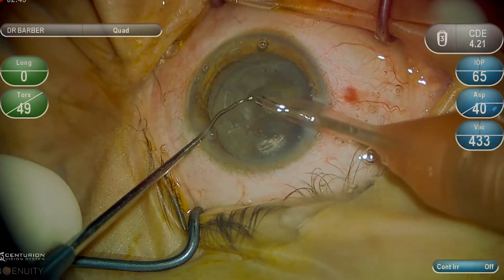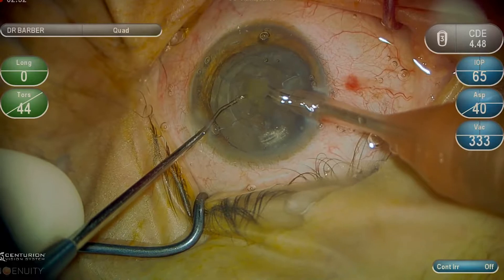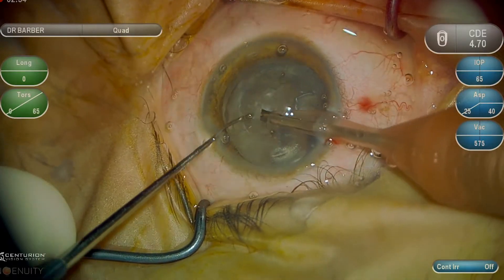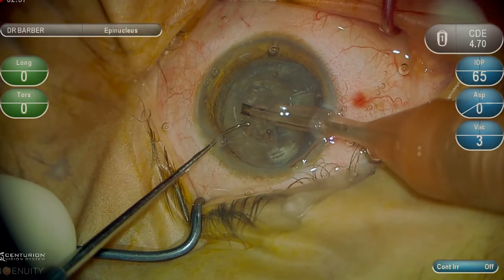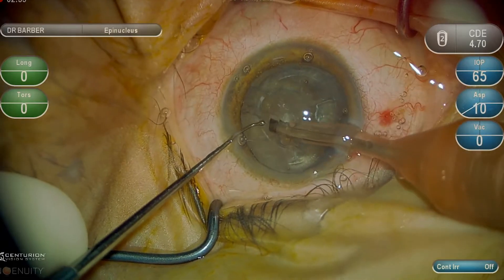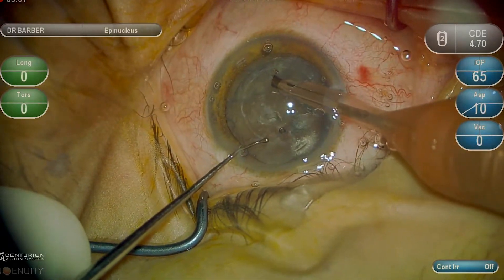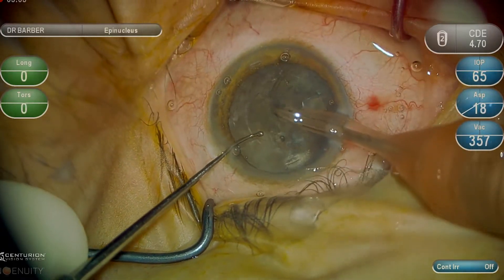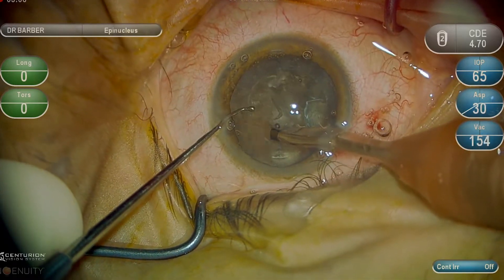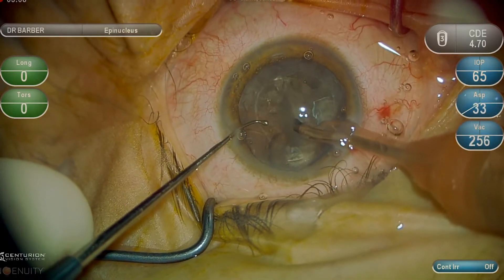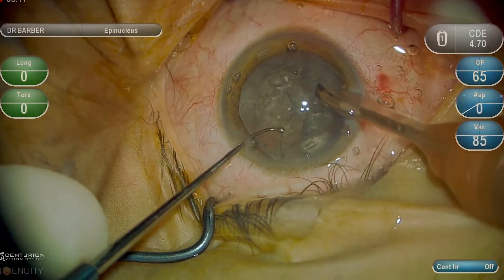Now, in this case, there is a dense epinuclear plate, so switching to the epinuclear setting, we gently try to aspirate the epinucleus. This was somewhat difficult, as the posterior capsule is difficult to identify with such dense asteroid hyalosis.